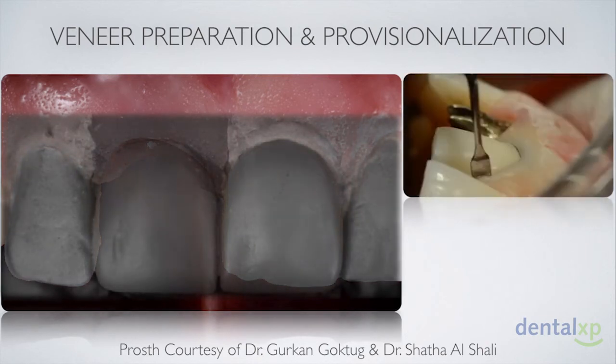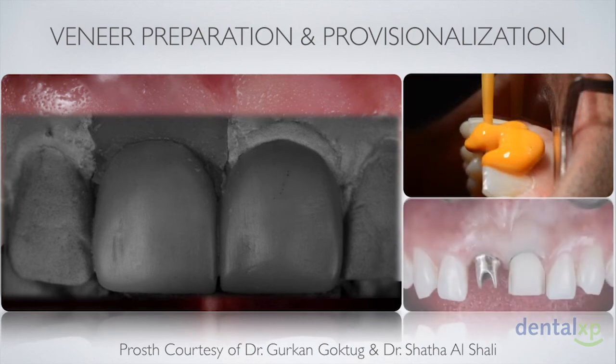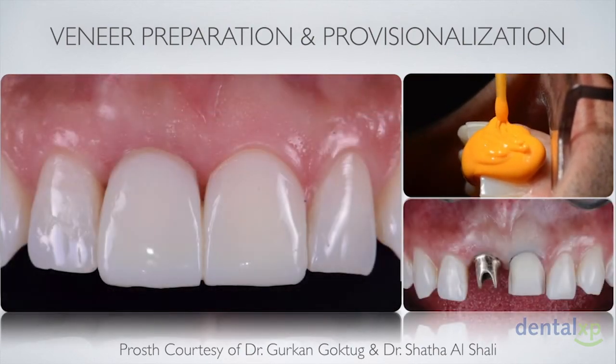The veneer preparation was performed as well as the abutment try-in, and this is the result we were able to achieve immediately following provisionalization of both central incisors, with an adequate aesthetic outcome that required really minimal restorative tissue development and a minimal amount of surgeries.